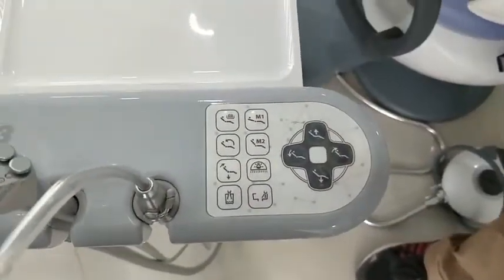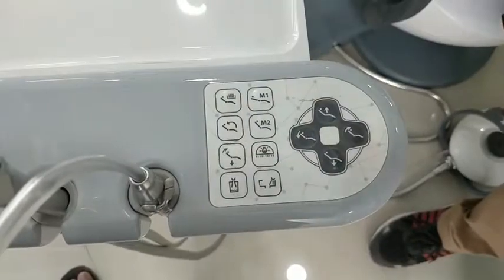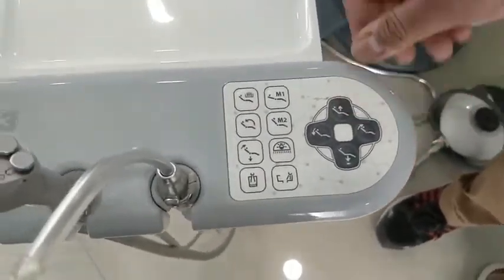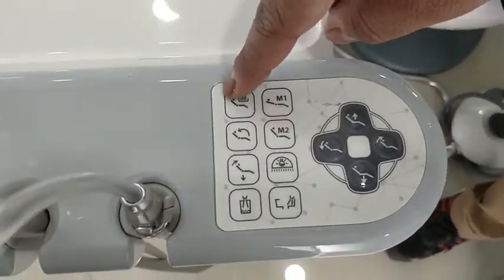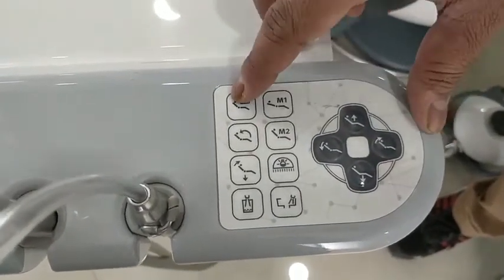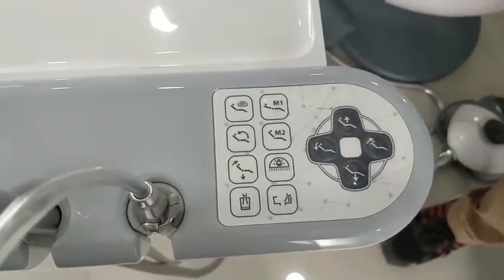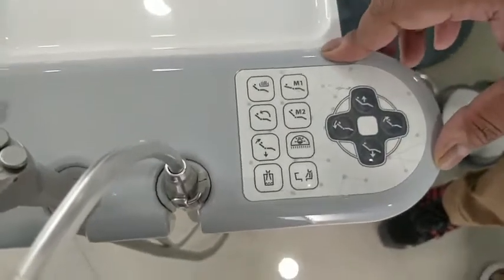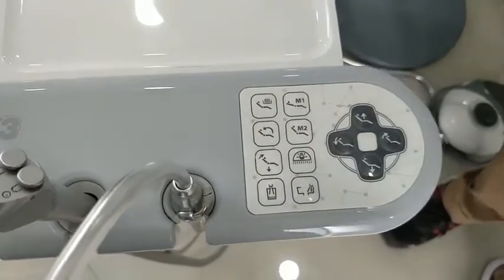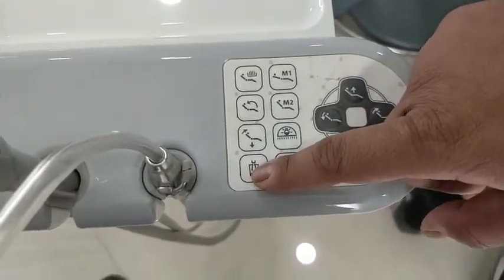The assistant panel buttons are similar to the main dentist panel and placed according to frequency of use. The first button puts the chair into the rinse or gargle position. The second button is the return button, which brings the chair back to the position where the doctor was performing dental procedures. The third is the rest position.